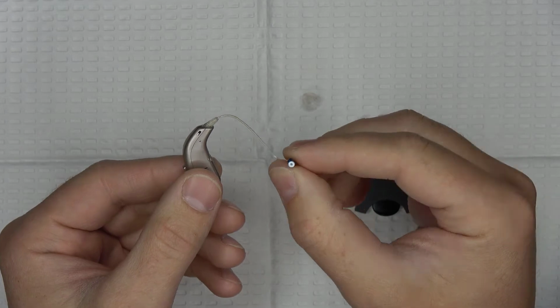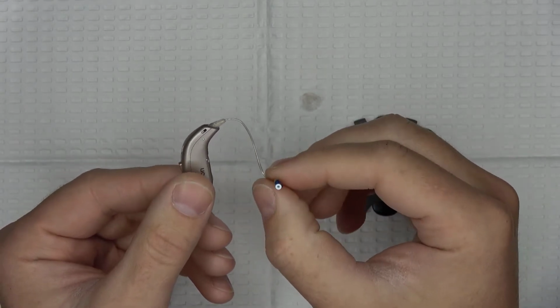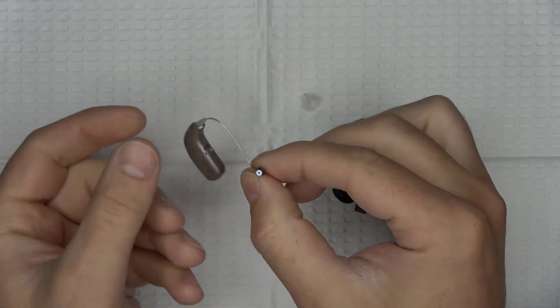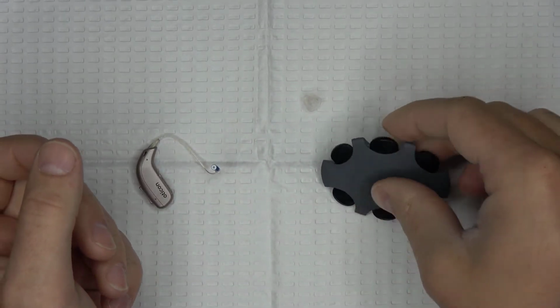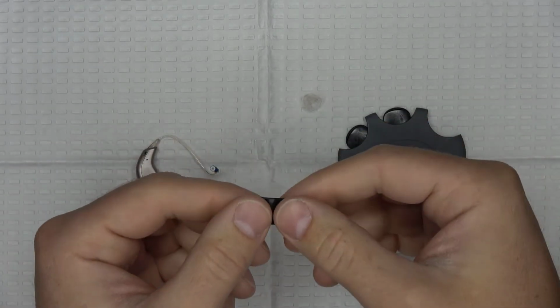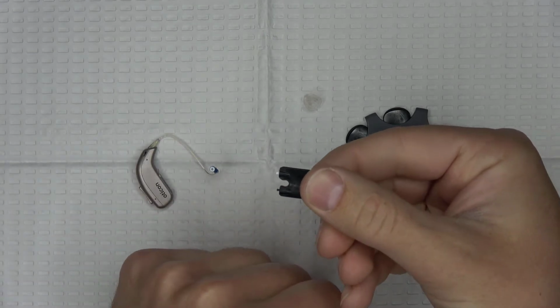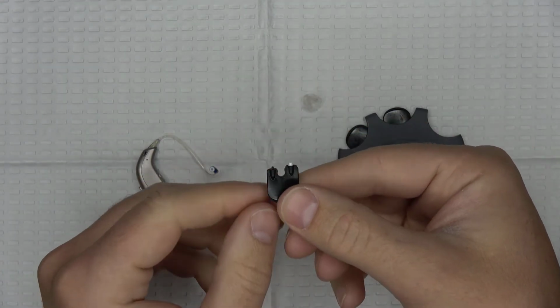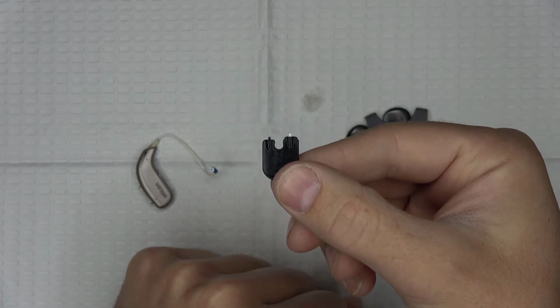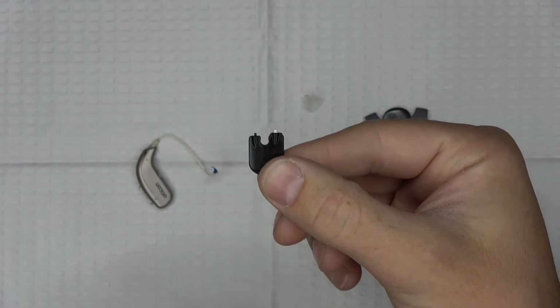Next, look to see if there is any earwax that is caught or stuffed in the opening of the receiver. If there is, then it's definitely time to replace the wax guard. Start by taking a pack of wax guards and remove one of the 6 removable plastic picks from the pack. I like to call these picks because, to me, they look kind of like a guitar pick. Once removed from the pack, take a look at the tip of the pick, and you should see a rough shape of a U, where one tip of the U is holding a new wax guard, and the other tip of the U is completely empty.